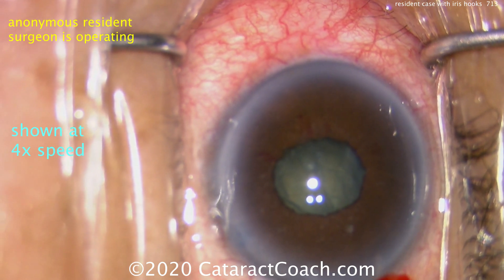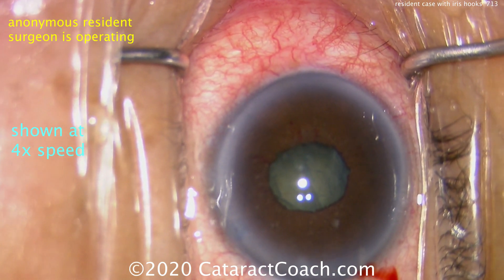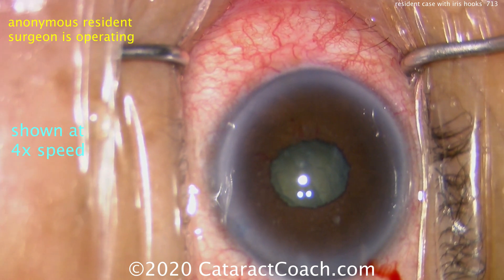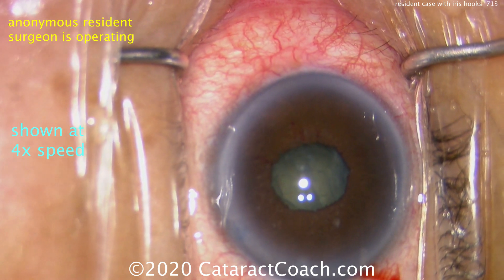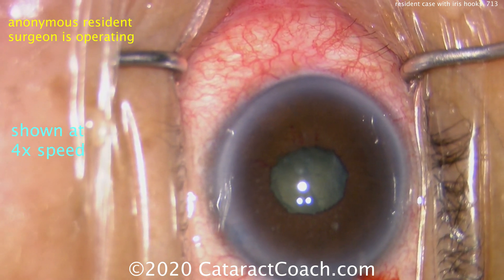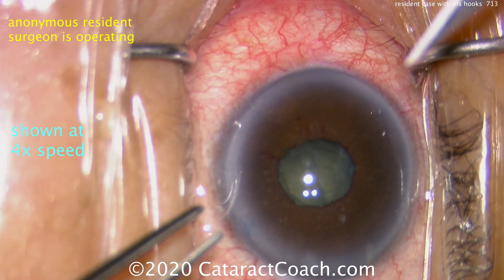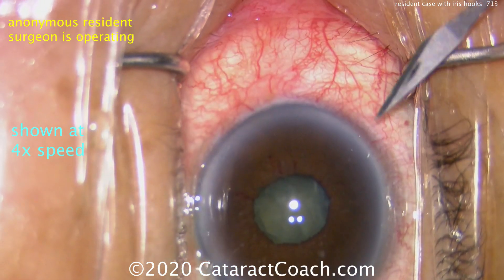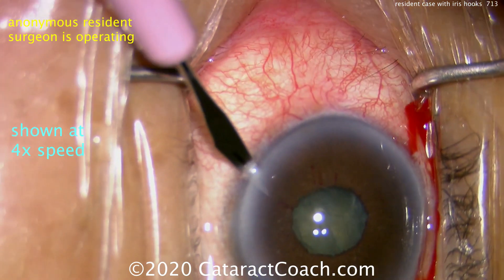Under a viscoelastic fill — the anterior chamber is filled with a dispersive viscoelastic — we're now ready to put in the iris hooks. A couple of key points: because you already have a capsulorhexis, when you place the iris hooks, make sure they're grabbing just the iris and not inadvertently going around the capsulorhexis edge.